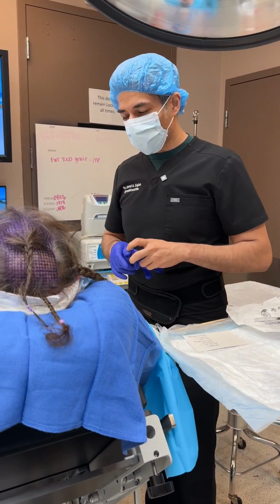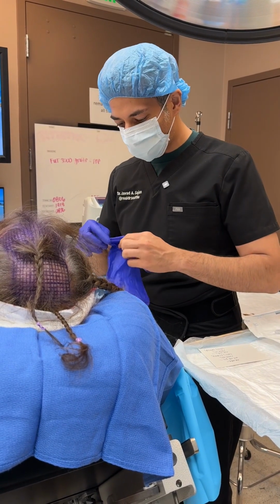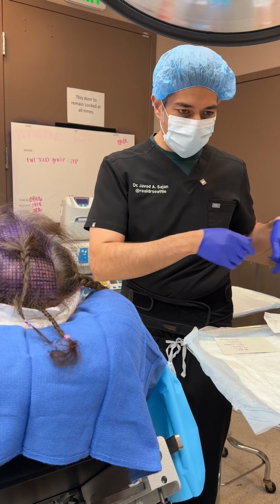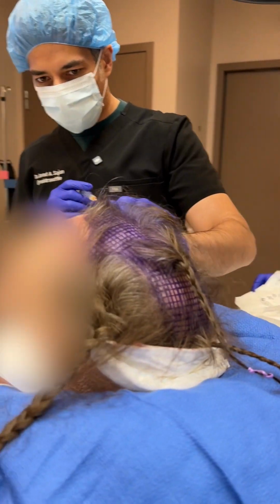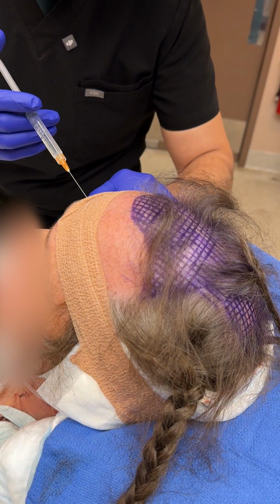We're gonna start with the nerve block first, okay? So we're gonna stay away from the brain, but we're gonna numb the nerves that go to your scalp, so we can do the holes properly. So the first thing we're going to do is block what's called the supraorbital and supratrochlear nerves, okay? You're going to feel a little pressure on 3. 1, 2, 3.